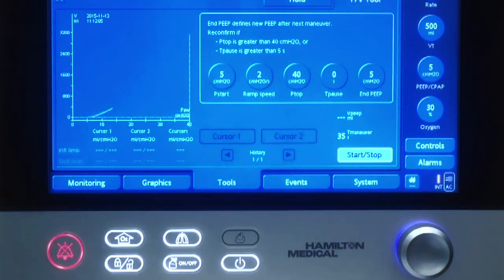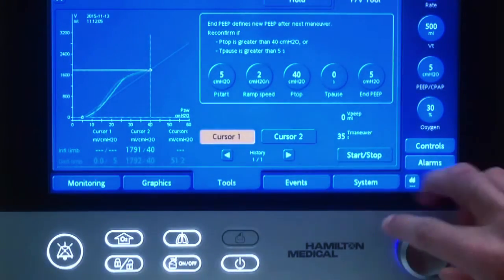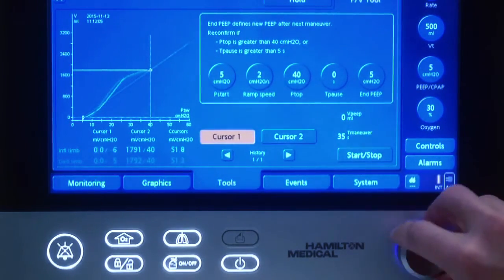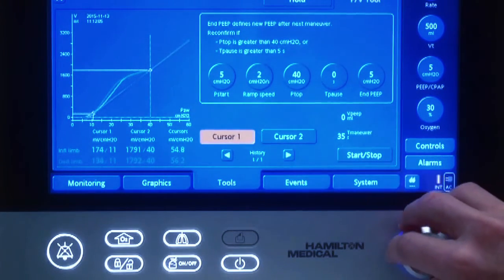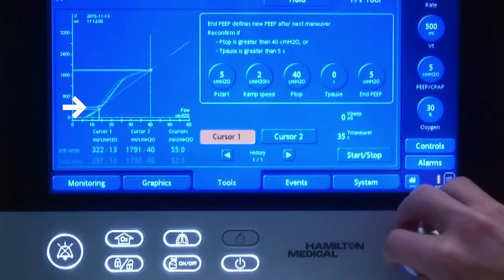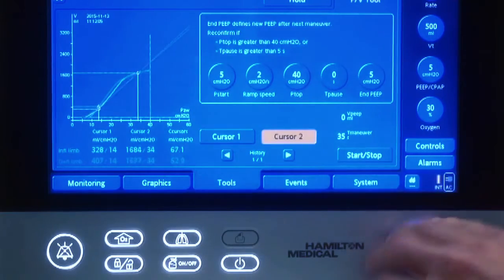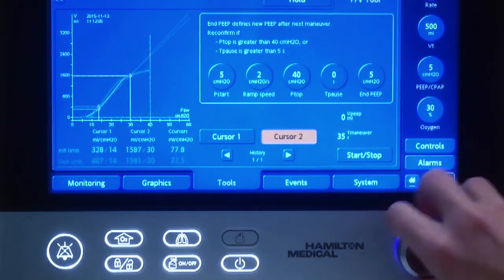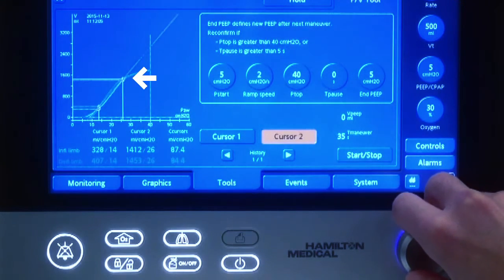Here I speed it up a little bit, and here we have it. We go with cursor 1 to find our lower inflection point — 14 in our case. And then with cursor 2 we look for the upper inflection point, which is 26 in our case.